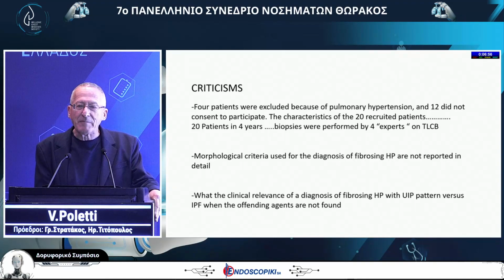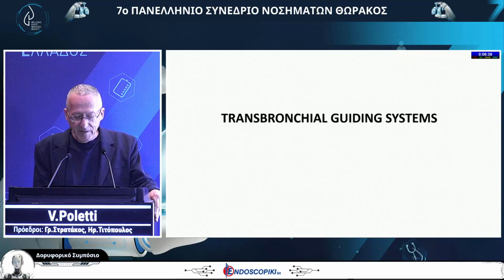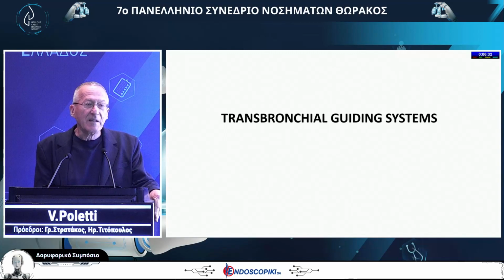So I think the main problem of these articles is that cryobiopsies are performed in non-expert centers. It happens with surgical procedures too. If you make some surgery, you are not expert in the field. Do we need a guiding system? This is another important problem.